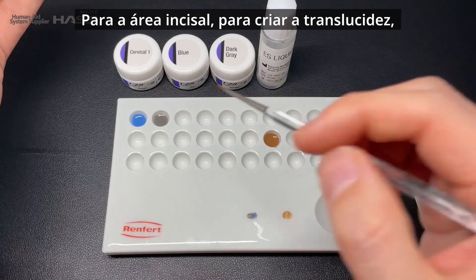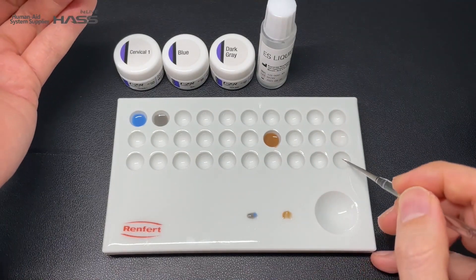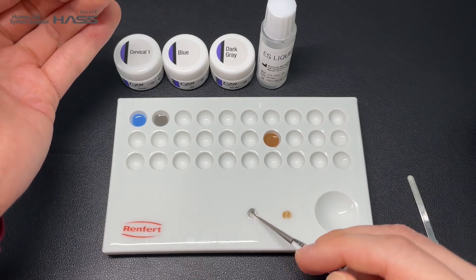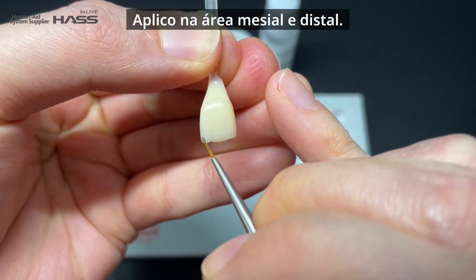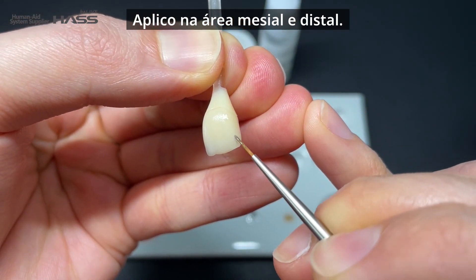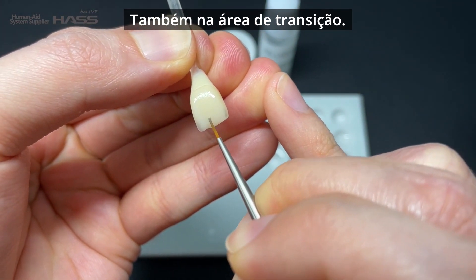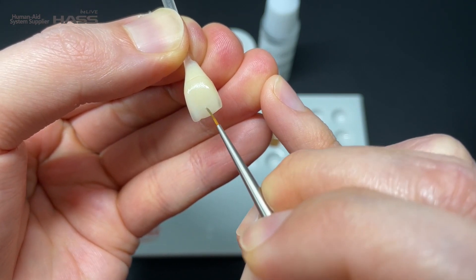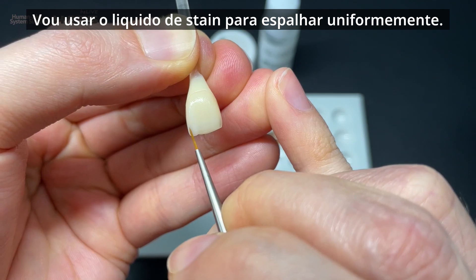For the incisor area, to create translucency, I'm going to mix blue and dark gray together and apply it on the incisor and also the transition area. I'm going to use stain liquid to evenly spread it out.